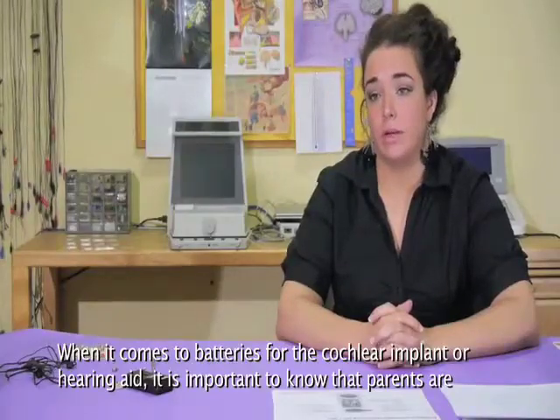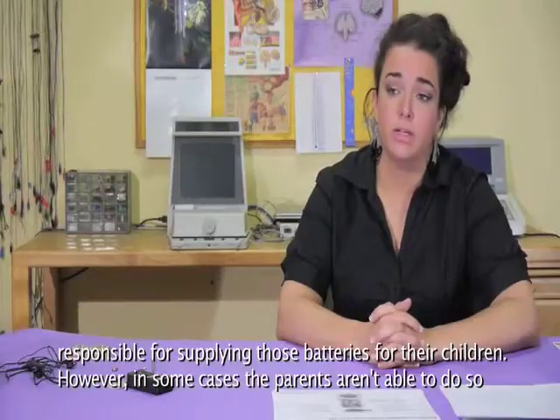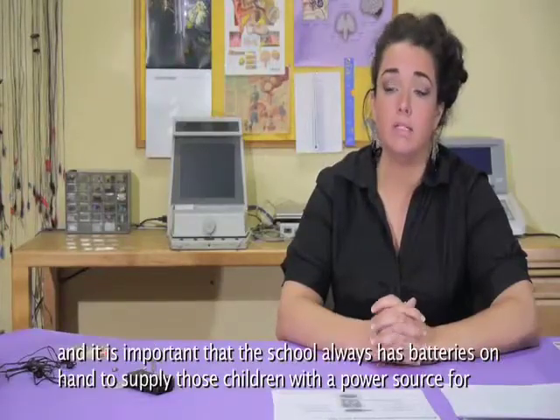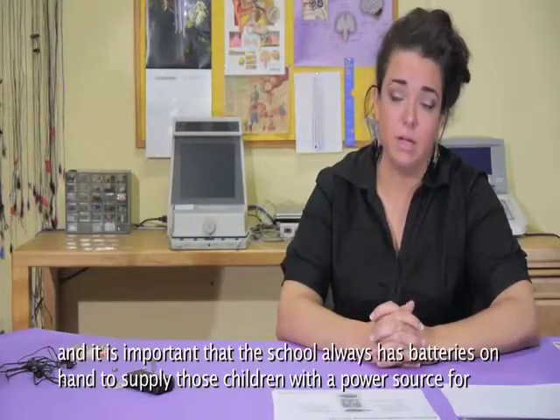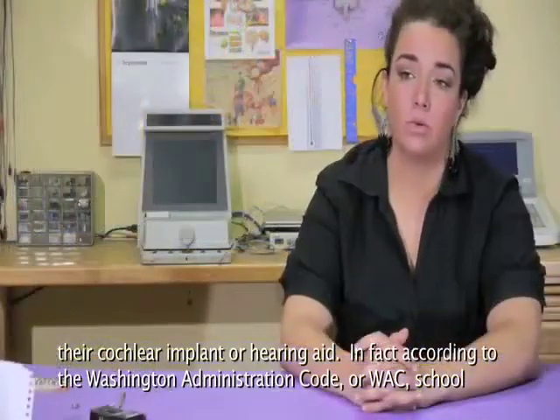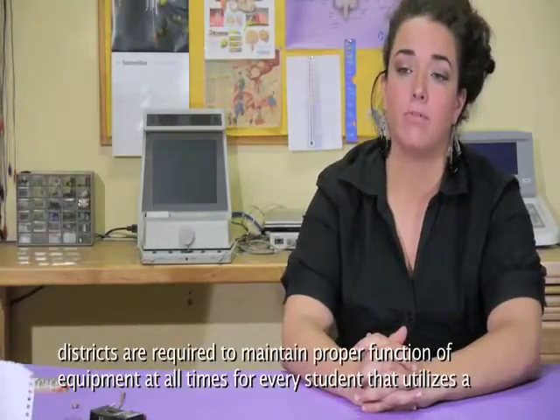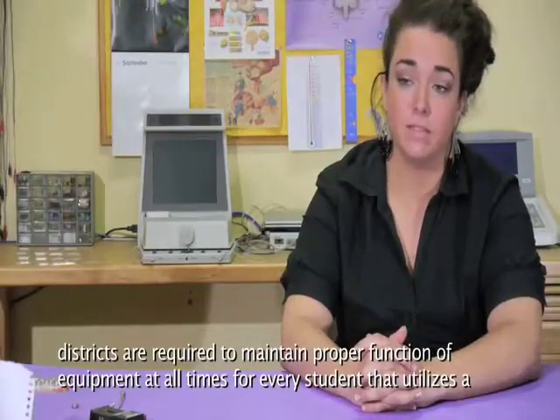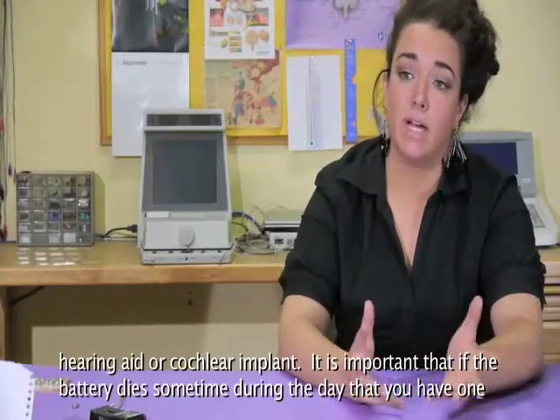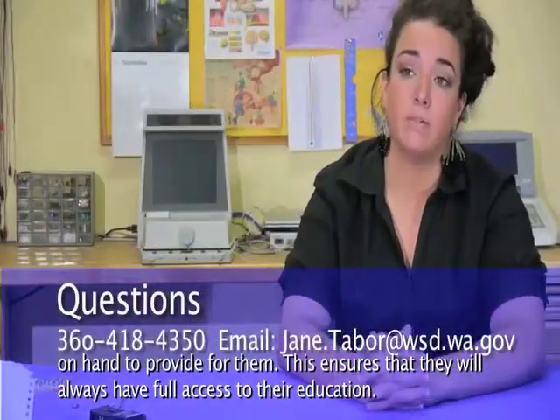When it comes to batteries for the cochlear implant or hearing aid, it's important to know that parents are responsible for supplying batteries for their children. However, in some cases parents aren't able to do so, and it's important that the school always has batteries on hand. According to the Washington Administrative Code, or WAC, school districts are required to maintain proper function of equipment at all times for every student who utilizes a hearing aid or cochlear implant. If the battery dies during the day, having one on hand ensures that students will always have full access to their education.